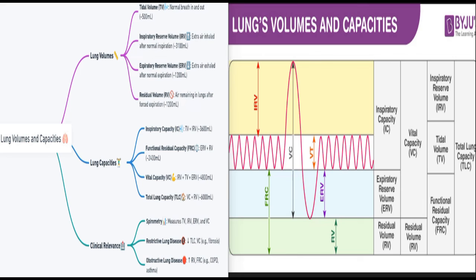The second descending part of the flow volume curve links the value of the PEF and the value of the residual volume, and is relatively effort independent, and it reflects the peripheral airway resistance and lung elastic recoil.